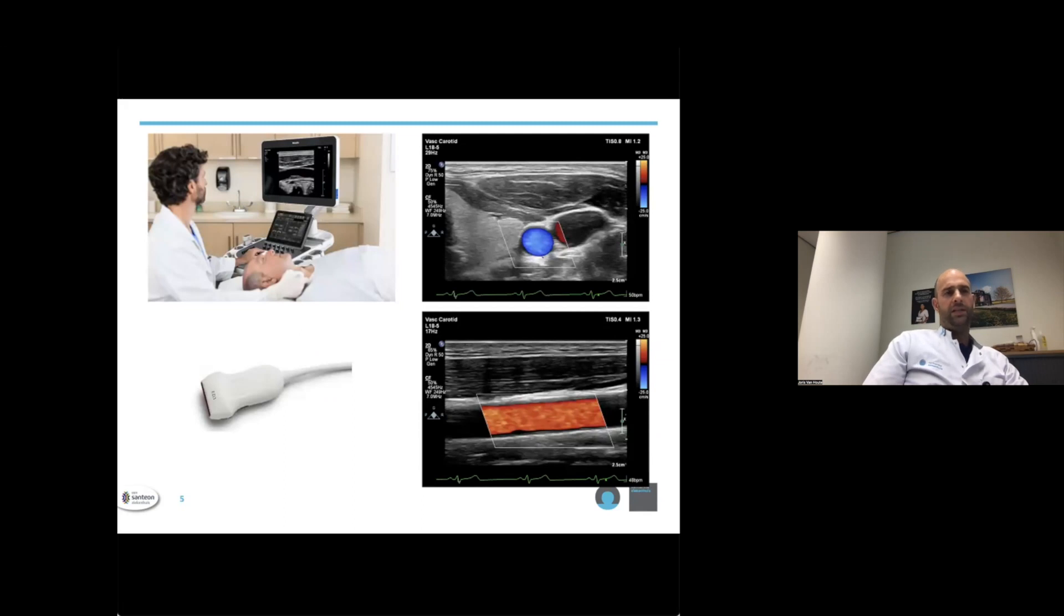During a carotid doppler examination, the patient is lying supine with the head slightly rotated. The common carotid artery can be easily visualized with a linear array transducer with a high frequency rate, as shown in the left lower image. In the right upper corner, a short axis colored doppler image of the common carotid artery is seen, with the internal jugular vein just lateral. In the right lower corner, you can see the long axis view of the carotid artery as a nearly straight tube. This is, however, not always the case.